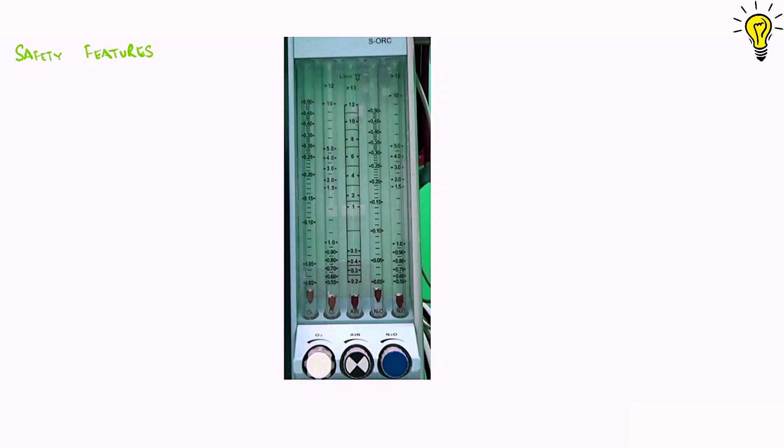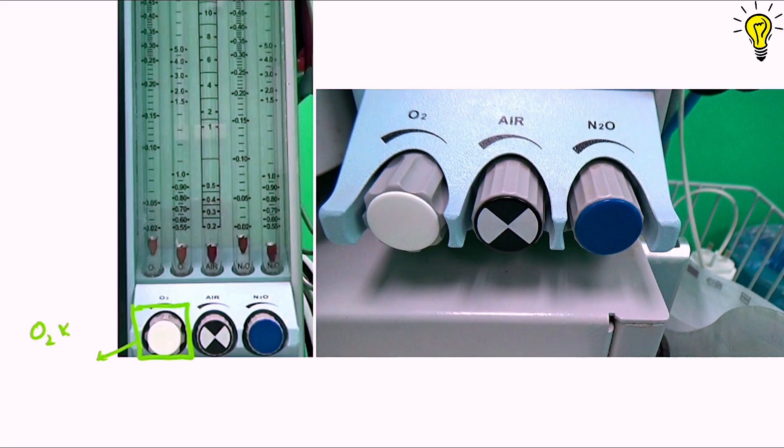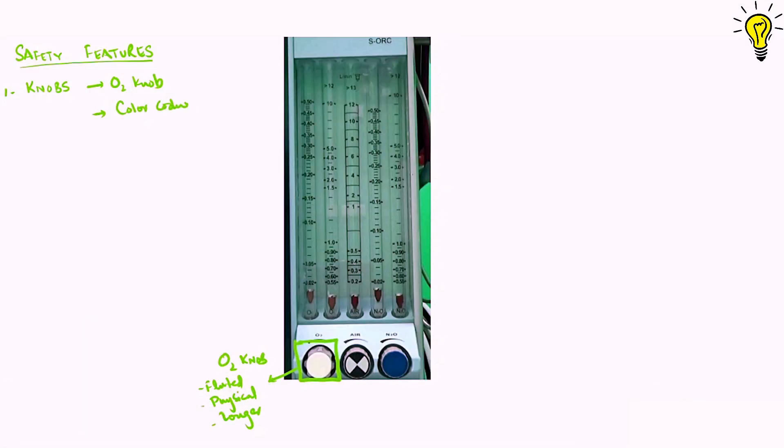Now coming to the safety features of flow meters. Number one, the knobs. Each gas knob has different physical properties. Oxygen knob is characteristically longer, fluted and its grip is different, so that you don't make a mistake while opening wrong gas. Next, these knobs are color coded. White for oxygen, black and white for air, blue for nitrous as per the standard color codings. Thirdly, these knobs have shields that prevent them from moving inadvertently.